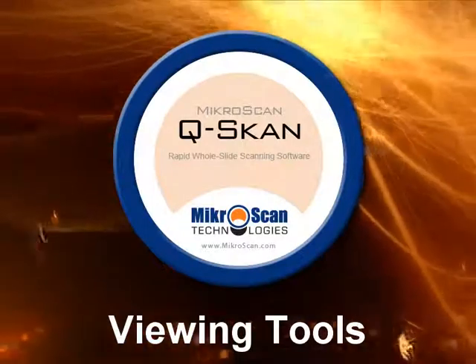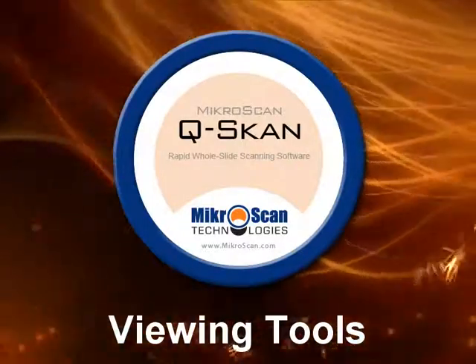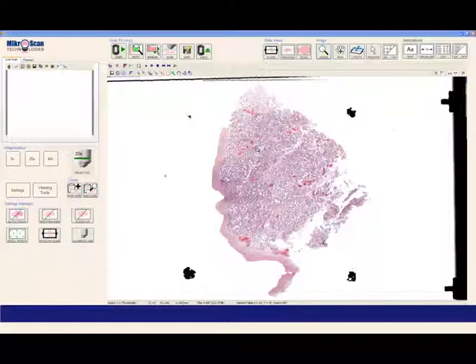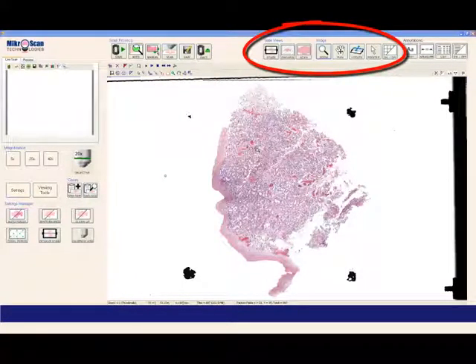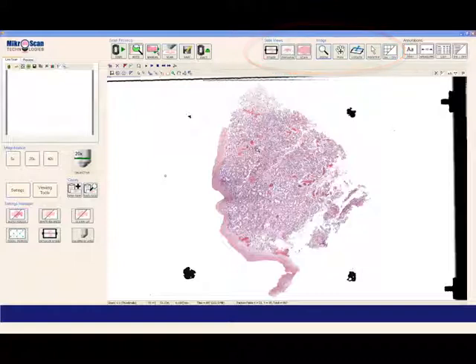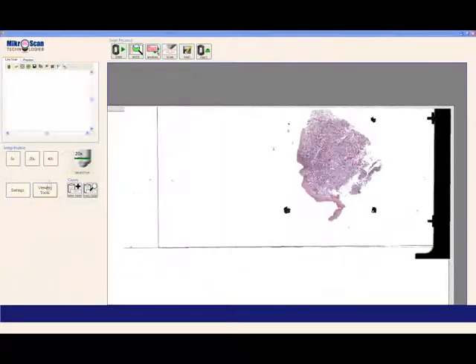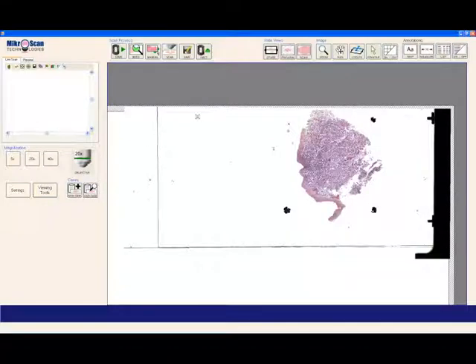Welcome to Microscan. In this presentation, we'd like to share with you some of the viewing tools that you'll be using with the Microscan. When your sample is ready to be viewed, the viewing tools will show up automatically. Otherwise, the simple press of one button will enable all the viewing tools for you to use.